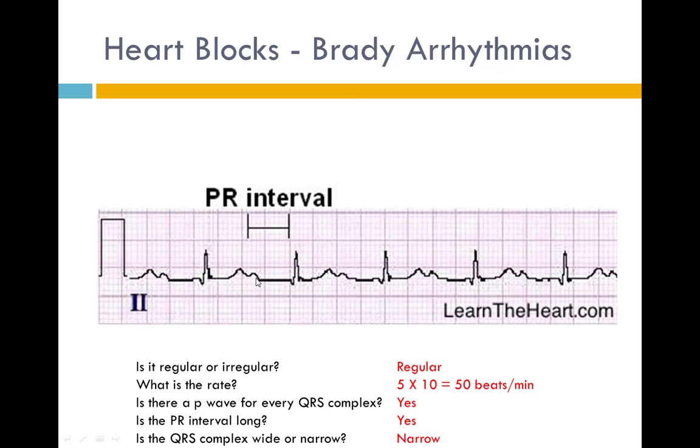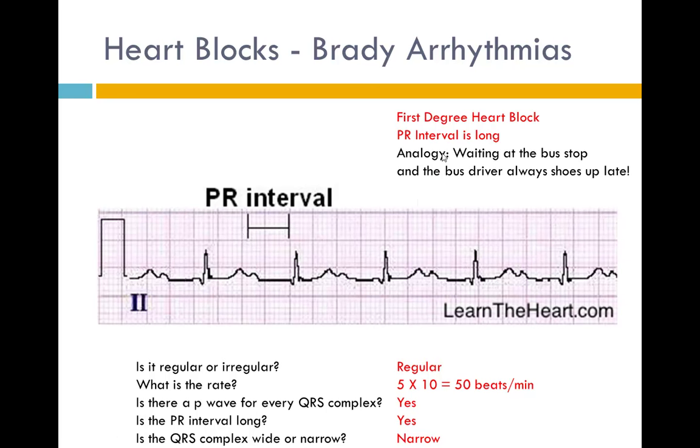The distance between the P wave and this R wave is extremely long. And it's consistent. You can see the P wave here to here, here to here, here to here. All measures out the same. So again, back to that bus analogy, where you're waiting at the bus and the bus driver always shows up late. The PR interval is always long. So that's first degree heart block. People live in first degree heart block. So this heart block isn't as serious as some of the others we're going to talk about.